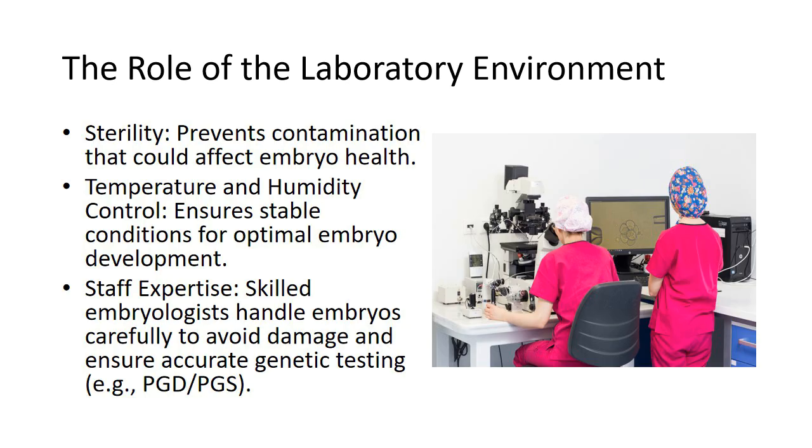The laboratory environment in ART is not just about the technical aspects of embryo culture, but also the overall atmosphere in which the work takes place. Creating a controlled, sterile, and optimal environment is critical for ensuring embryo development and improving ART outcomes.